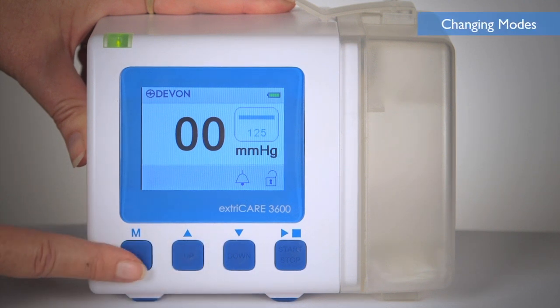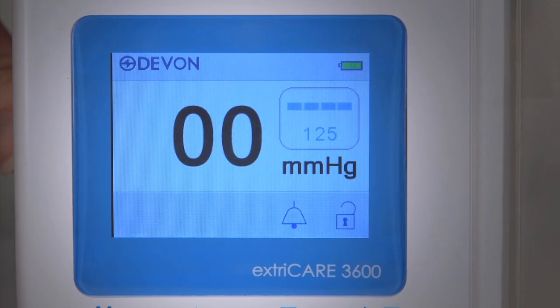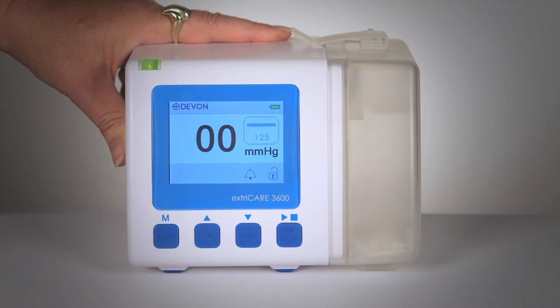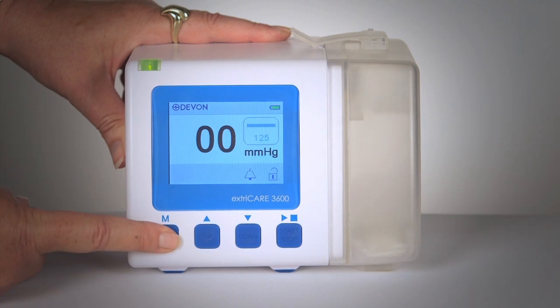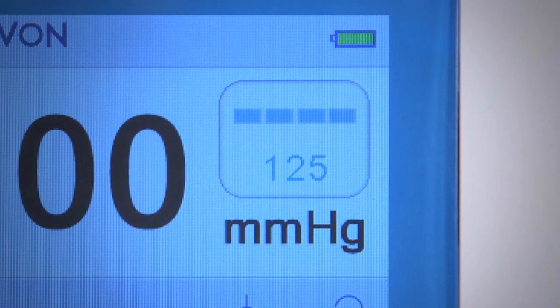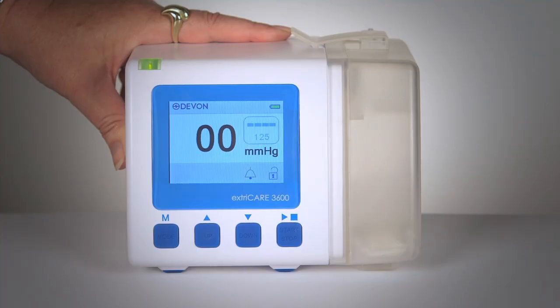To change the operating mode, press and hold the mode button until the mode icon changes. The ExtraCare 3600 can operate in continuous or intermittent mode. If operating in continuous mode, a solid line will be displayed on the screen and the device will operate at the pressure set by the user. If the device is operating in intermittent mode, a dashed line will be displayed on the screen and the ExtraCare 3600 will operate for 5 minutes at the set pressure, for 2 minutes at 20 millimeters of mercury, and then will repeat.